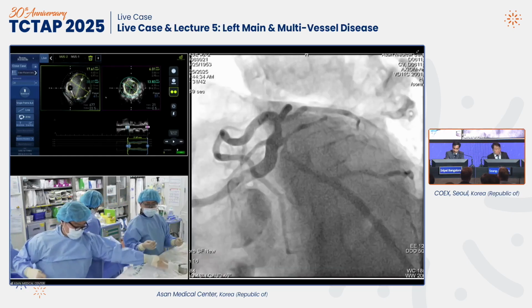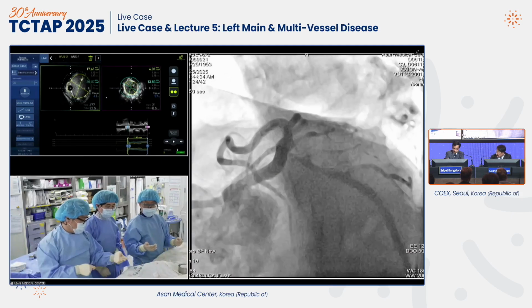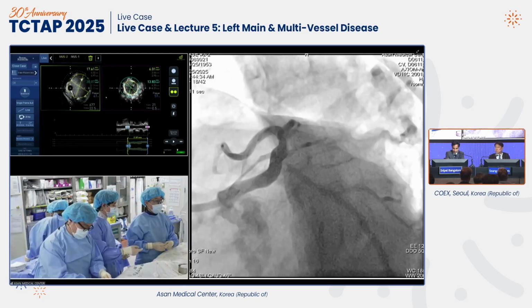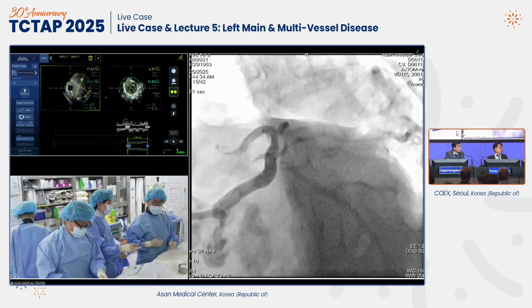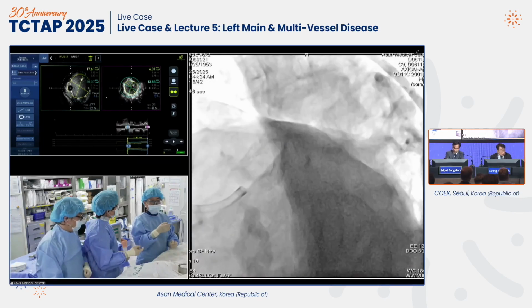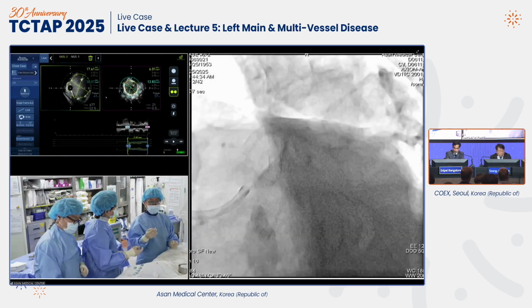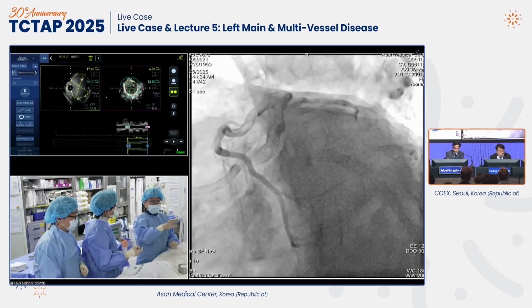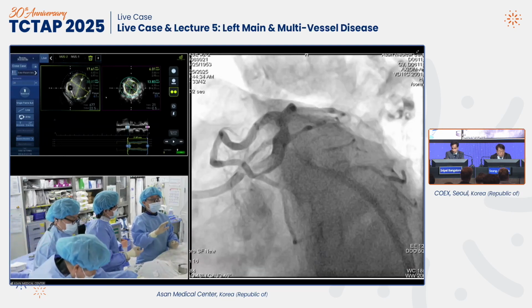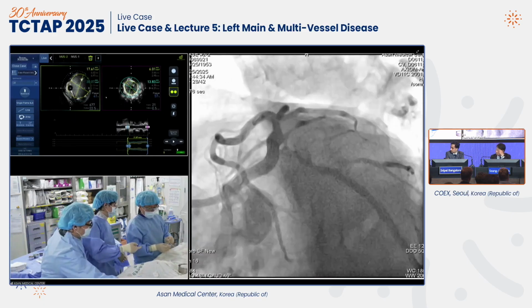We are still concerned, as nowadays there is some booming about DCB application for the left main bifurcation region. We have much experience with DCB application for the circumflex ostium. My feeling is that almost all cases show very severe dissection. Although it looks good angiographically, if you do imaging, there is a severe dissection. My fundamental feeling is not good. Just leave it alone. DCB is angiographically somewhat ambiguous. I'm not sure that the patient is absolutely good for long-term follow-up. I agree. Any experience?